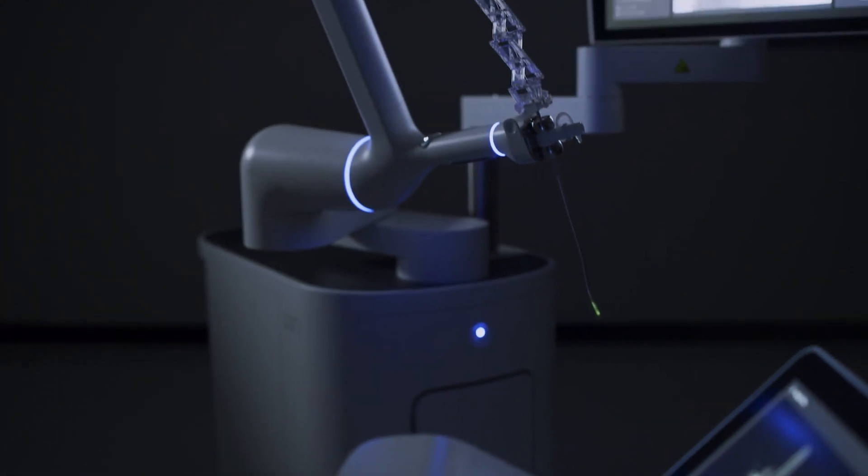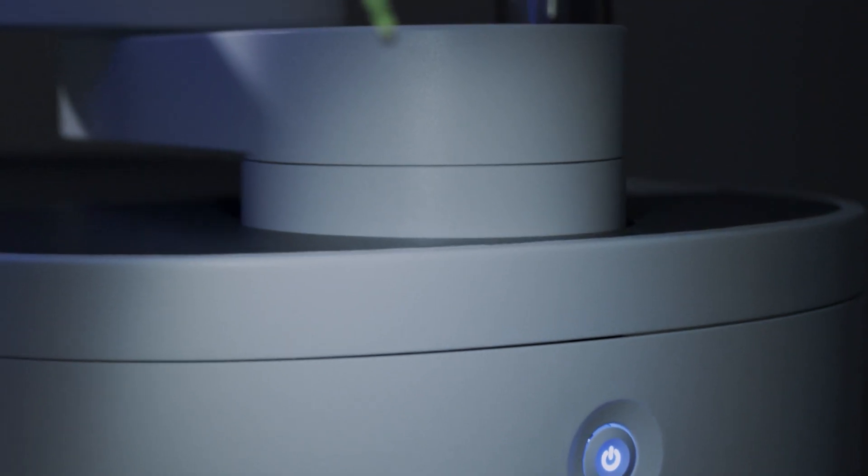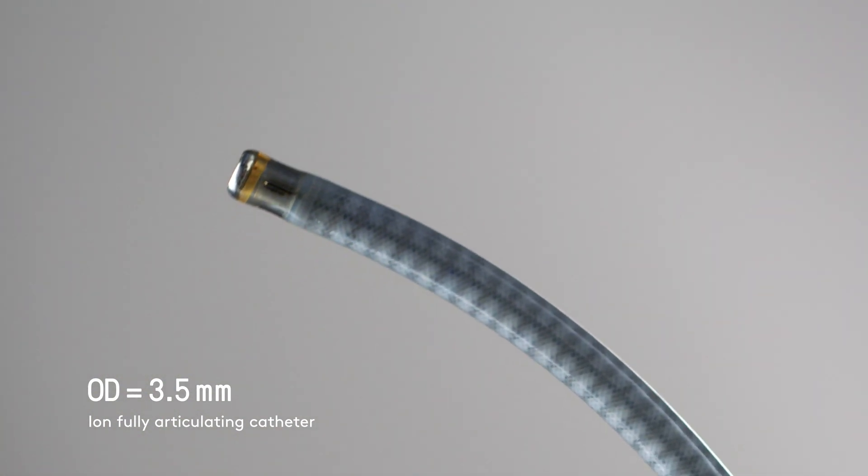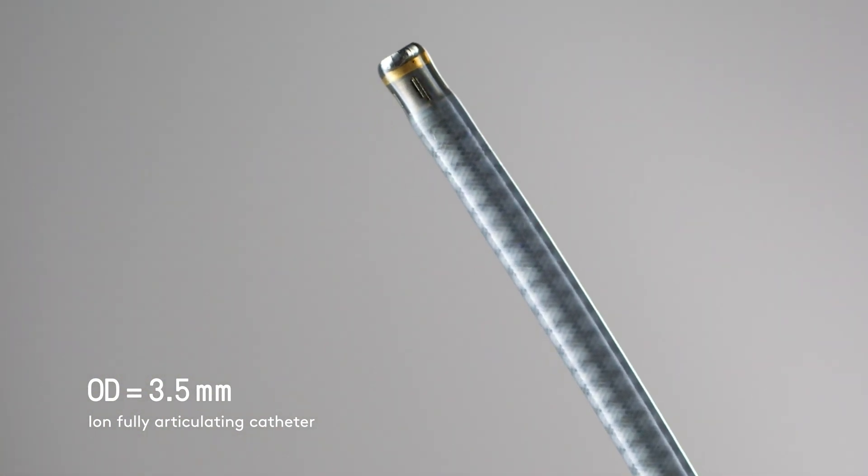We've designed ION to overcome one specific limitation of bronchoscopes with a smaller catheter size. The outer diameter of the ION catheter is only 3.5 millimeters with a 2 millimeter working channel.